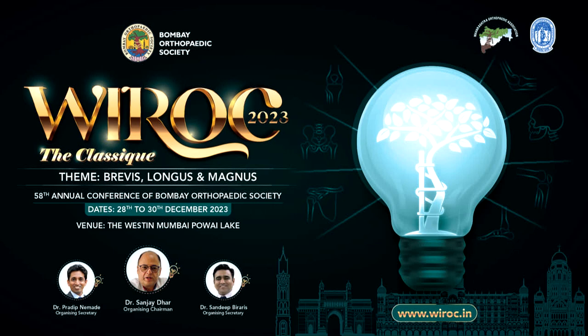I'll tell you, this has been my question for the last few years. I started with 5, 6, went down to 3, 4, and I've done all those: 3 screws, 4 screws, 5 and 6 screws also, and I looked up the literature. There's no real clinical literature telling us that you should do 6 screws or 5 screws. AO says 4 to 5 screws. That's what the AO manual says. Now, clinical evidence is not there and I've done many cases with 3 screws only, because I rely more on the cuff sutures going through the plate. Angular stability I achieve by the cuff sutures tied to the plate. So that is what I rely on more.